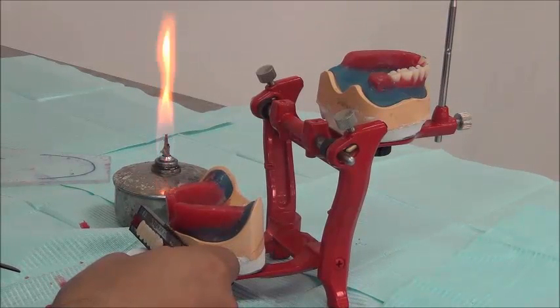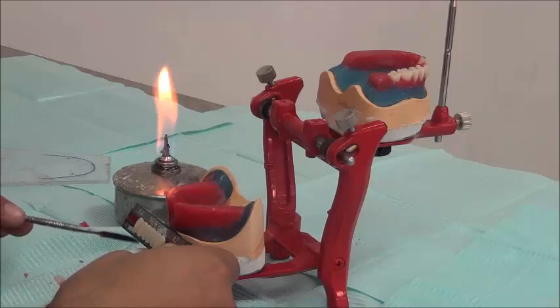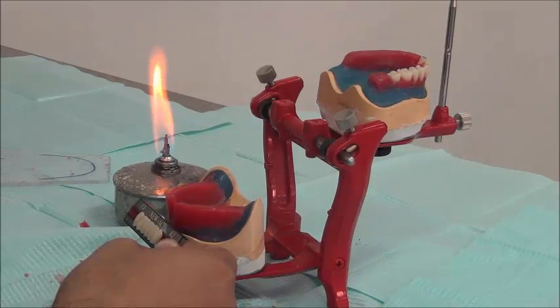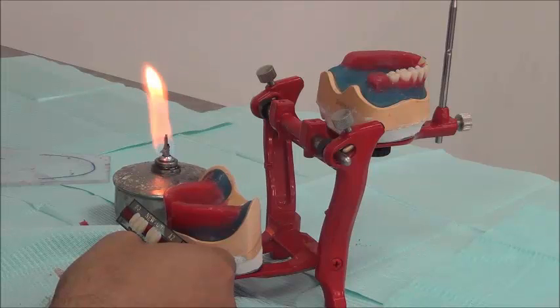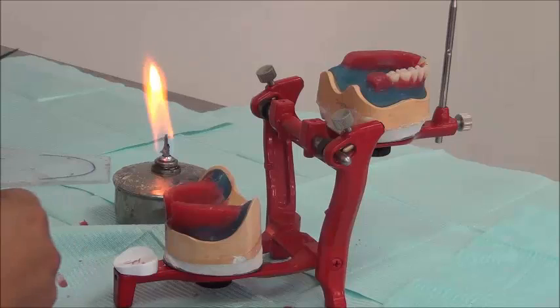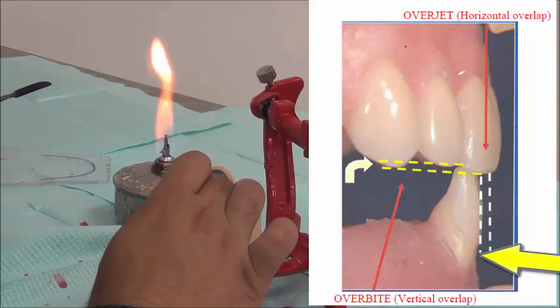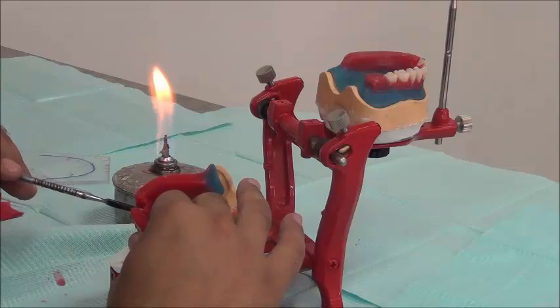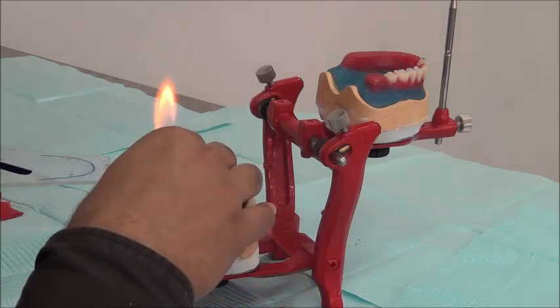For the setting of the lower teeth, make sure you do not mix teeth together because they look very similar. The midline on the set of teeth is where teeth are set to the right or left of it. Lower central incisors and lateral incisors are very close in morphology, so make sure you take the correct tooth — the first one to the midline. We open the box and melt down the area beneath the tooth before placing it in position, taking care not to remove too much wax.